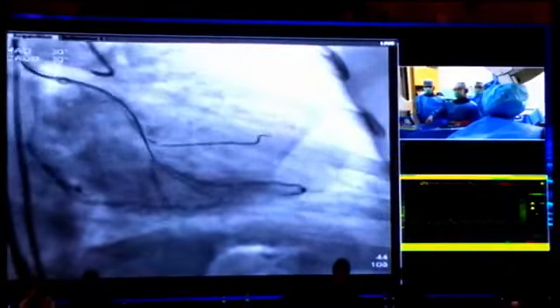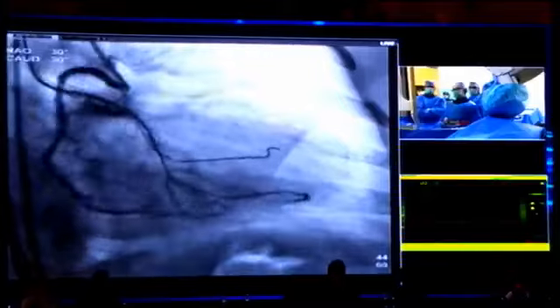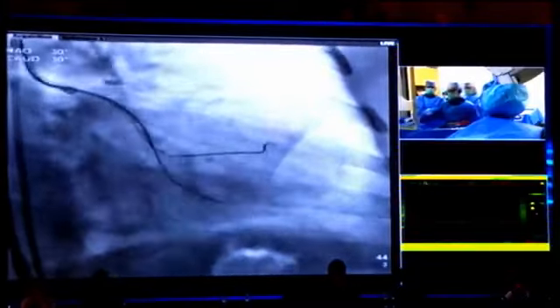this Gaia second wire is taken out and reinserted, it is like a gamble procedure, and in this situation it is very easy to advance this guide wire into the subintimal space, so my plan is keeping this guide wire. And additionally, I would like another guide wire and using a double lumen microcatheter. This is my plan.